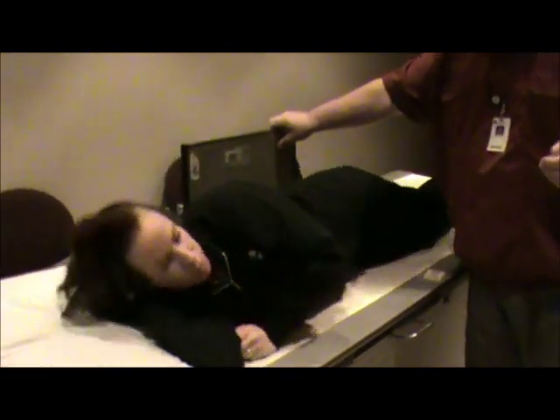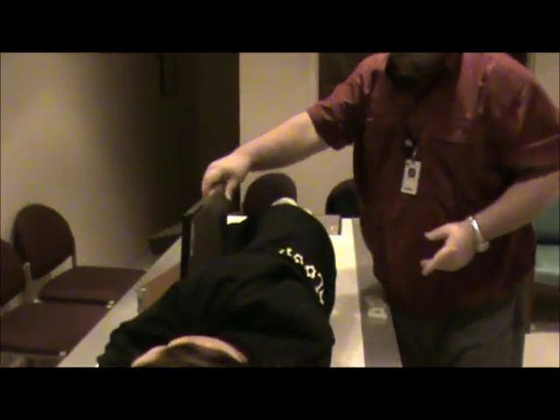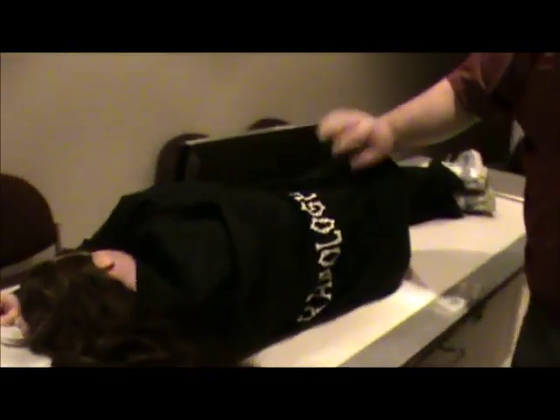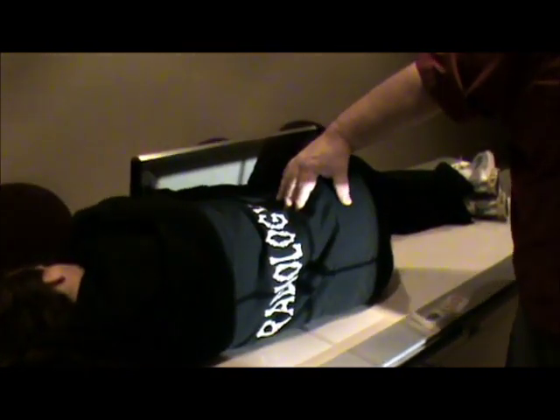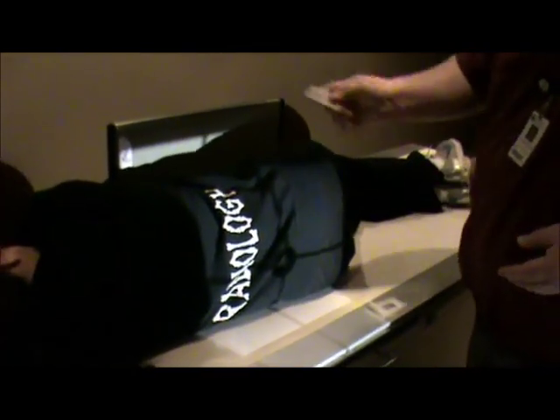Since the patient is going to have the tip in their rectum, we don't want to flip the patient to the other side of the table as we normally do on a decubitus for chest. So we're going to have the patient roll onto their stomach and then roll onto their left side. We only do this for the enema because we don't want the patient to move so much with the tip in. For the left lateral decubitus, we're looking at the right side. The hepatic flexure is not quite as high, so our centering will be at the level of the crest. The patient is on their left side, so the right side is up, and we want to mark the right side — the upside. This is a grid, and the technique remains the same: 77 kV at 32 mAs.